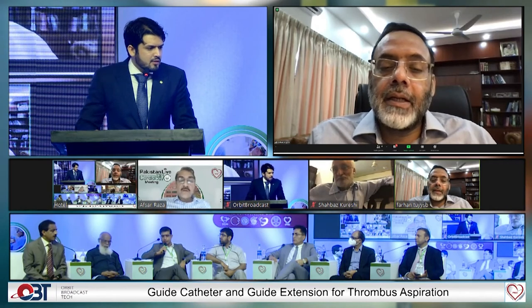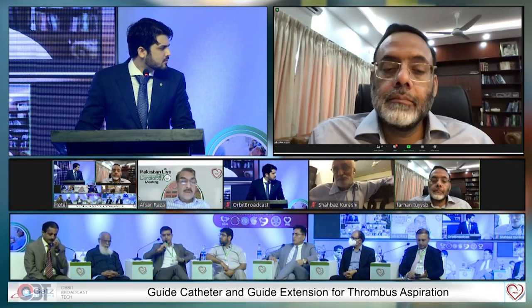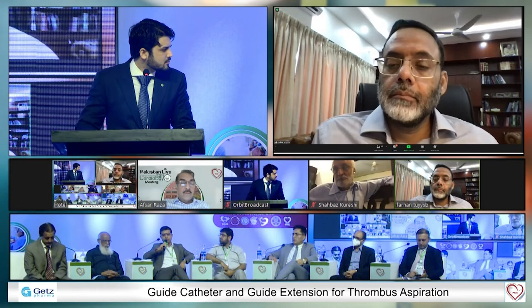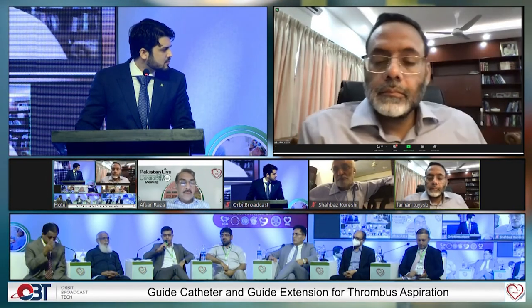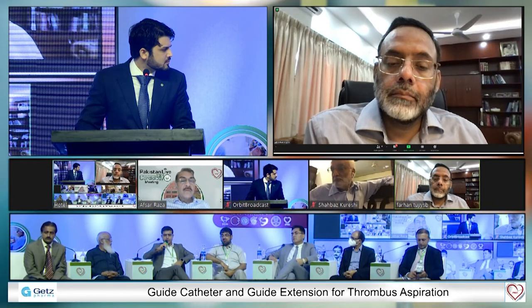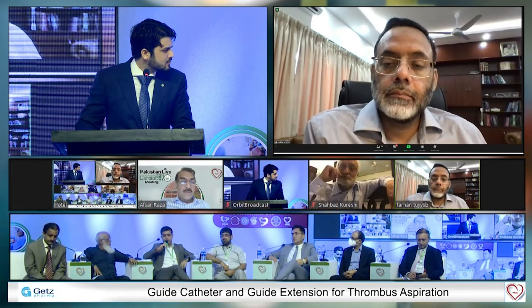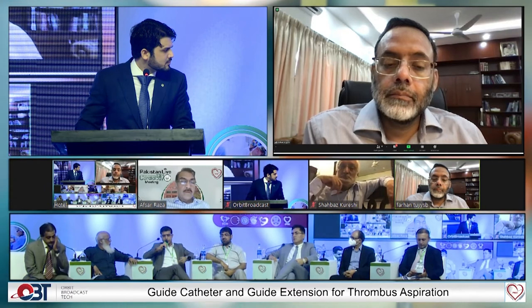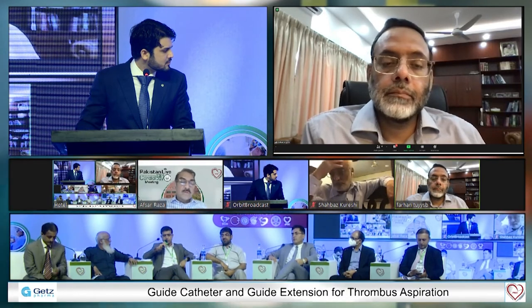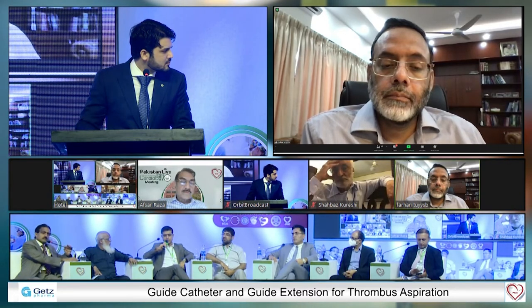Regarding acute setting, to answer Dr. Afsar Raza, even in acute setting, as this was the case, you just recanalize the graft by aspirating some thrombus and leave the patient on GP2B3A and bring him back after a week or so, and you can do retrograde intervention. And in this case, despite aspiration, the one thing in STEMI cases, we must do a long cine in the end to see the TIMI blush grade, because it is well correlated with tissue level viability and long-term outcomes. Even in this case, despite they have aspirated much of the thrombus, I believe that most of the thrombus has gone distal to the distal bed and has damaged the myocardium.